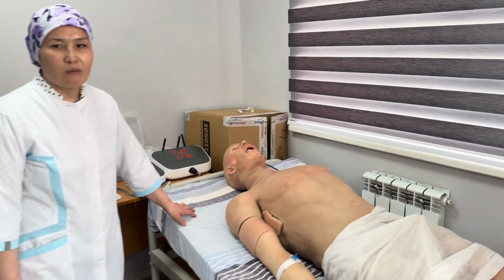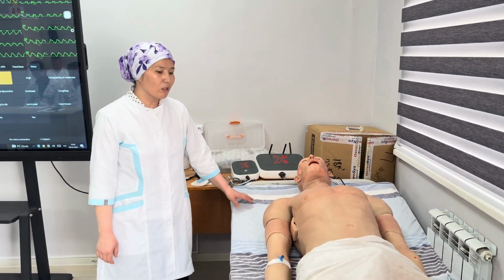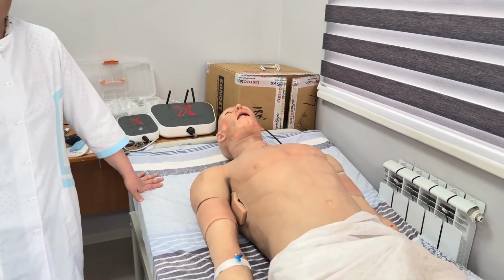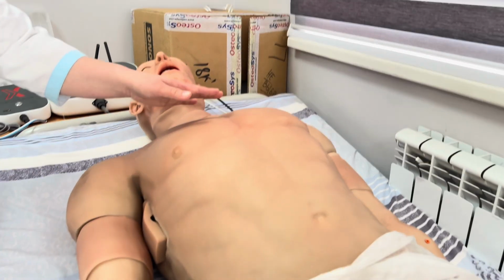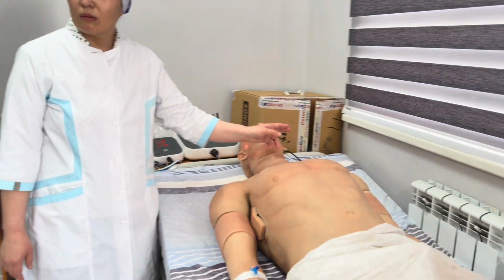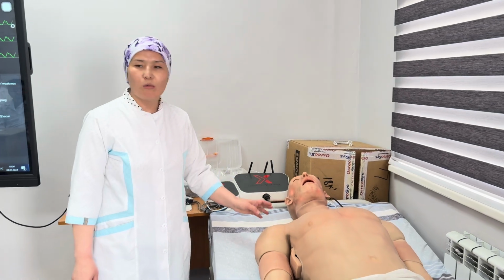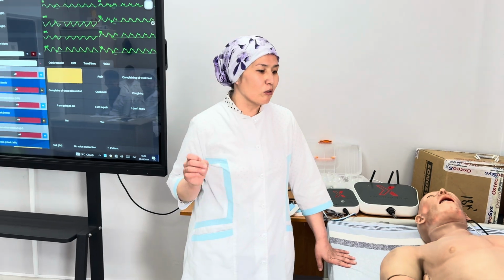This man is 36 years old, he has chest pain and shortness of breath, and the chest pain radiates to the left hand, left shoulder and left neck. Now please identify. Who can identify which diagnosis? Yes, come here.